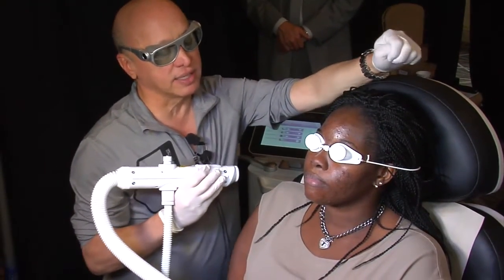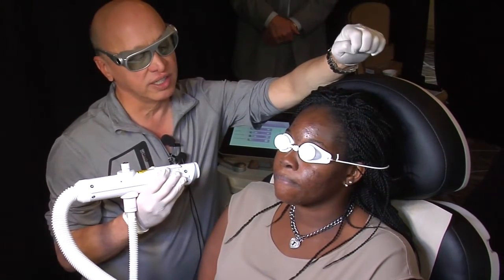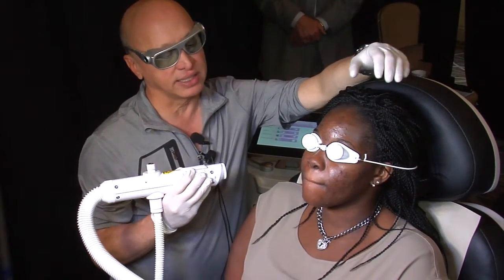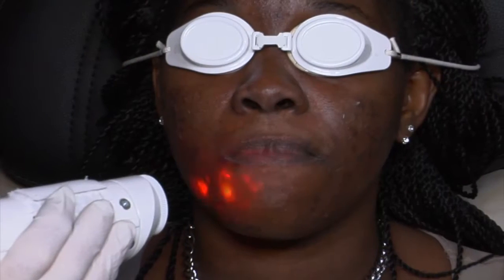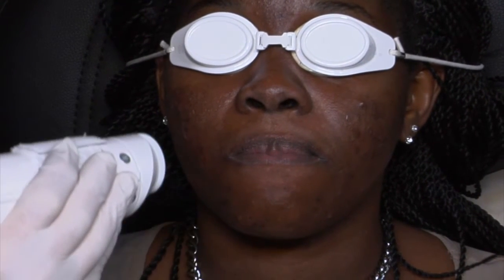She's got a lot of inflammatory pustules. It's going to impact on the inflammation in the vessels. It'll have a phototoxic, photothermal effect on P-acne and just improve her overall skin. And there's no cooling device in this at all — pretty simple, small device.